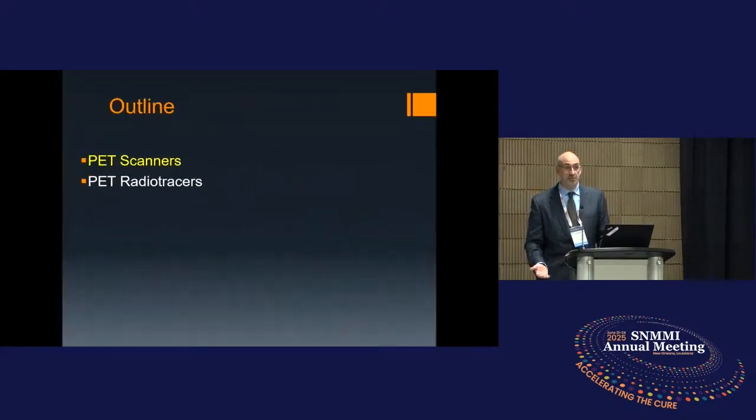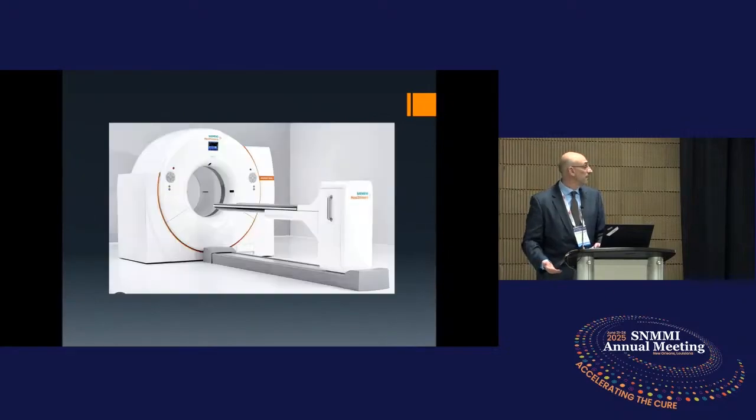First we'll start with PET scanners. With a PET scanner, there's a gurney, and there's usually a ring, and the ring is where all the magic for PET detection happens. For those of us who have had a PET scan or have had a loved one have a PET scan, the patient experience has been homogenized in a good way. You're going to go to a reception desk, you're going to be taken back by a technologist, and the technologist or a nurse or another medical professional is going to start an IV. They're going to give you a radiotracer.